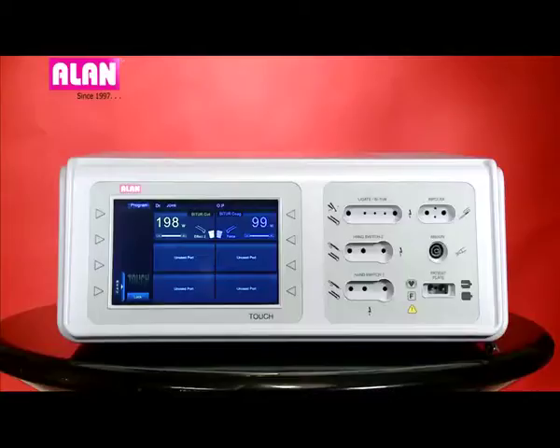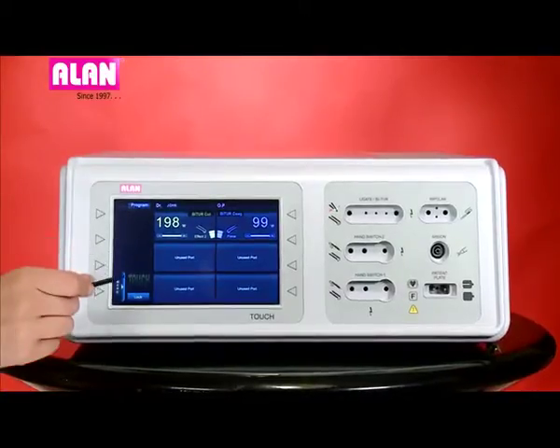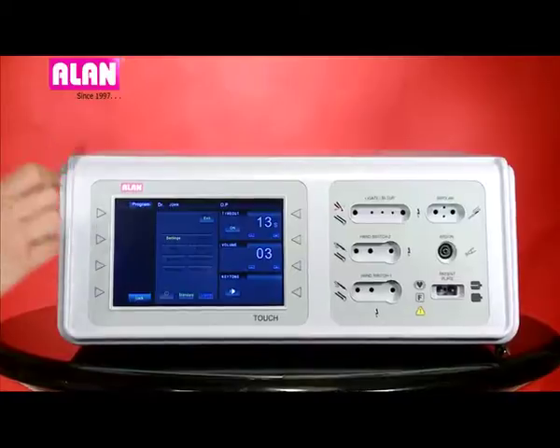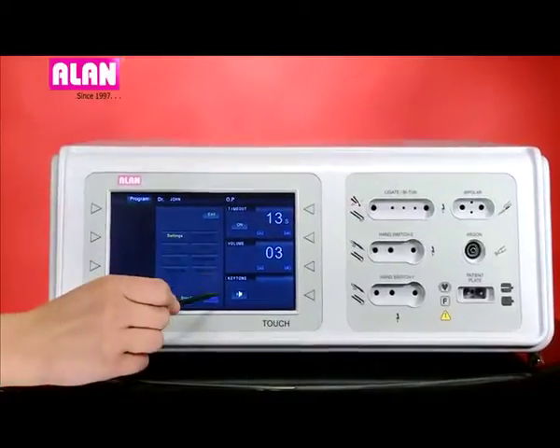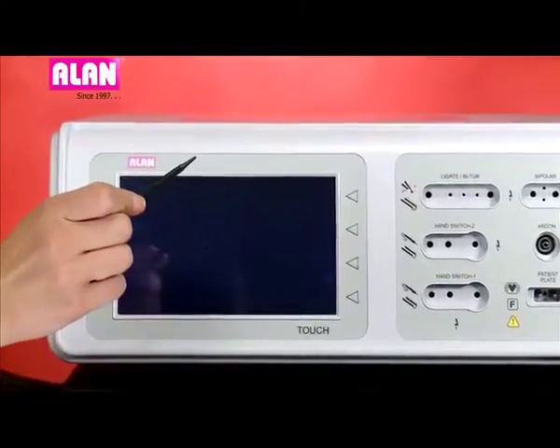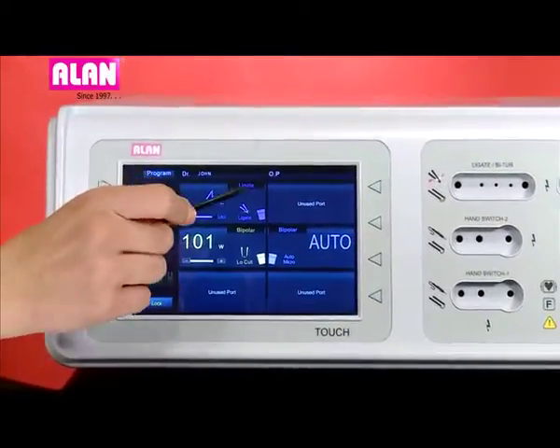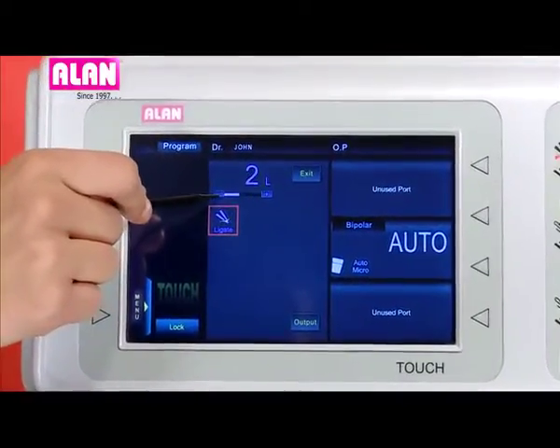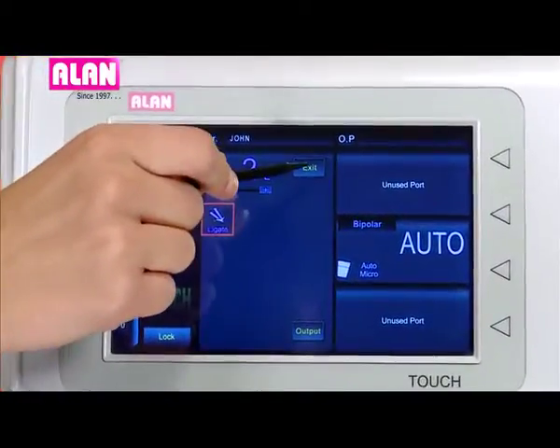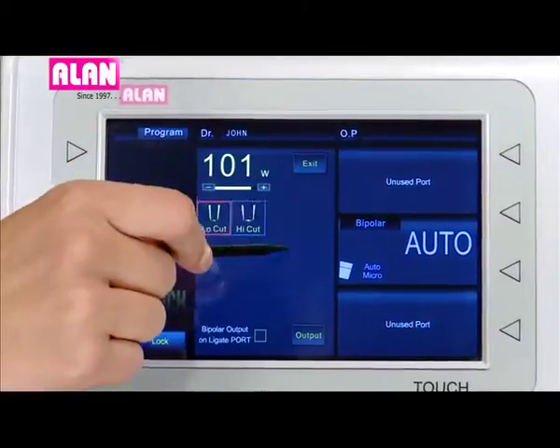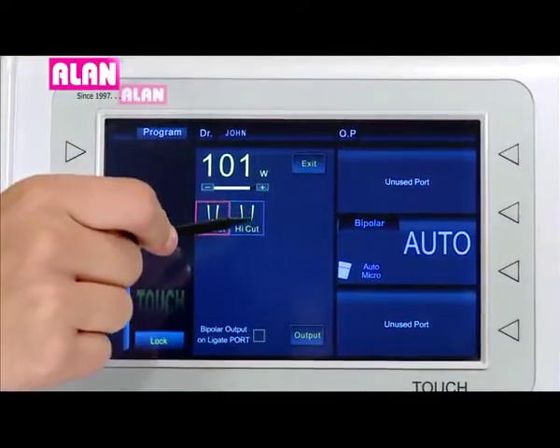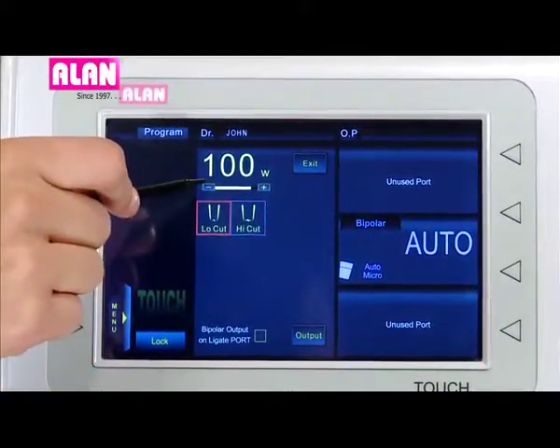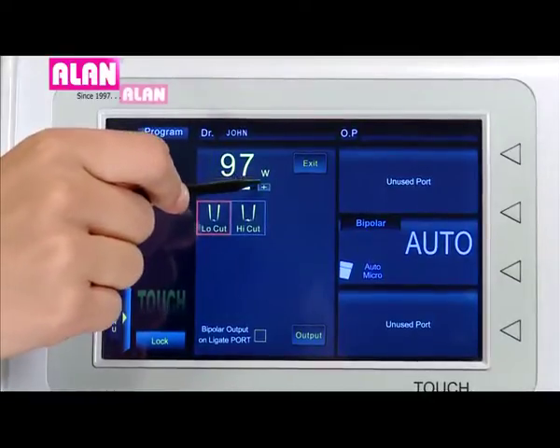In the same way, the user can switch to LiTUR mode by touching the menu icon and then the LiTUR icon. The system will initialize to LiTUR mode. The power levels, footswitch selection, and mode selection can be done for LiTUR mode.